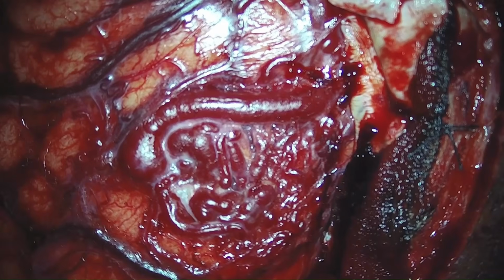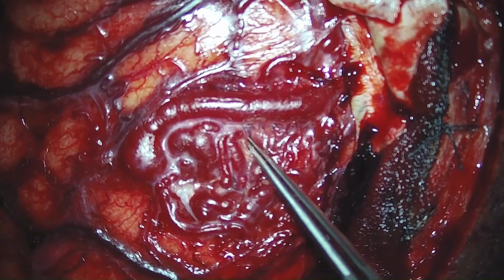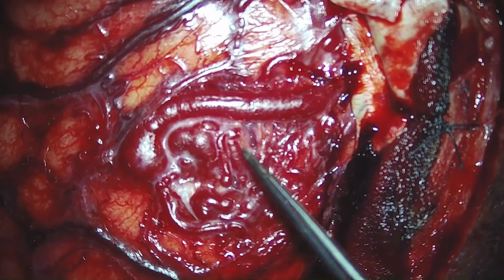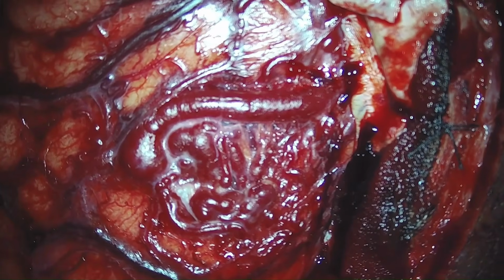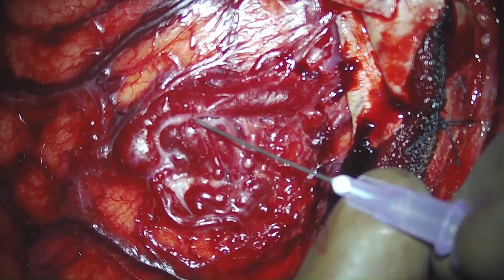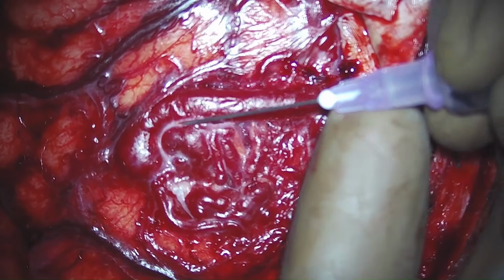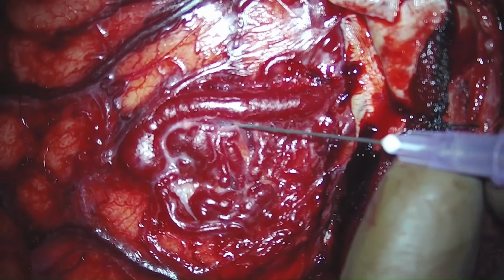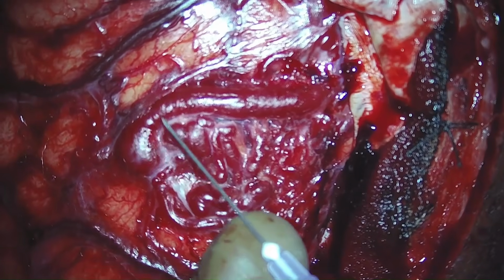So the AVM is very close to the superior sagittal sinus, and once we could delineate the main draining vein of the AVM into the superior sagittal sinus, we slowly started separating the AVM complex from the surrounding brain with an arachnoid knife, and we are slowly dissecting out the vessels.